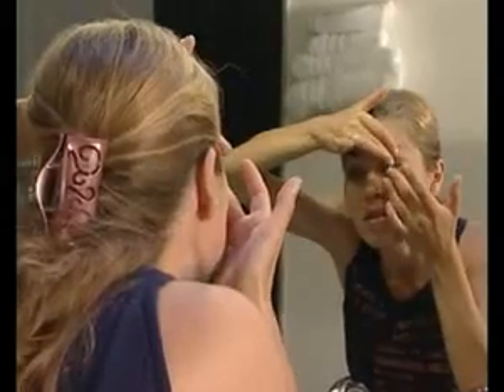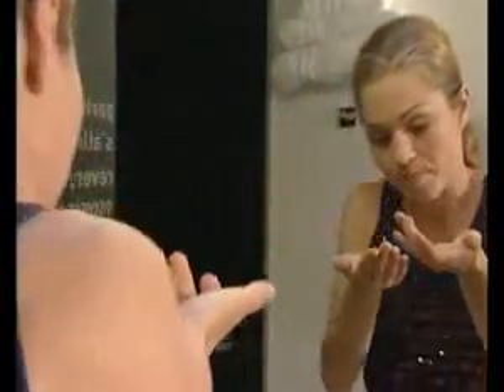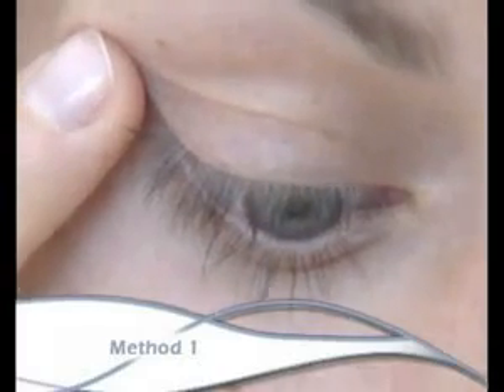Always remove the same lens first using one of these methods. With your eyes wide open and looking ahead, tilt your head forward and stretch the temporal edge of the eyelids, collecting the lens in the palm of your opposite hand.